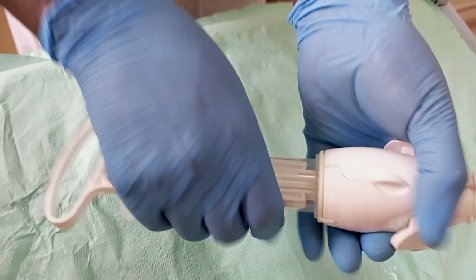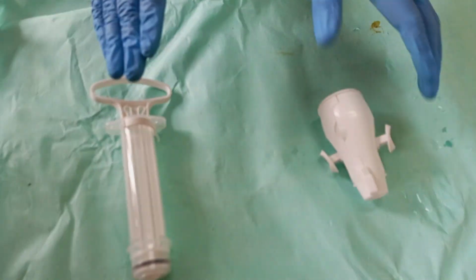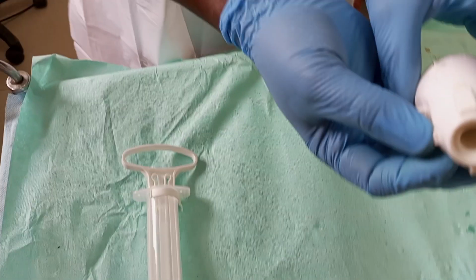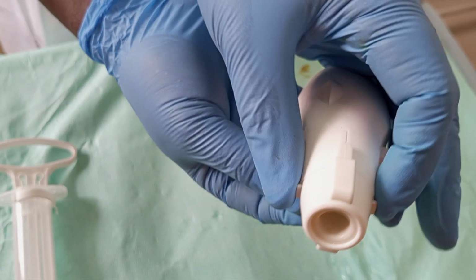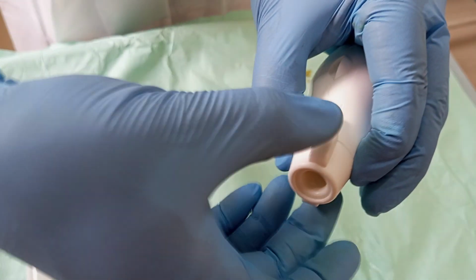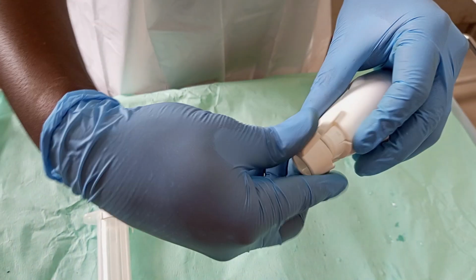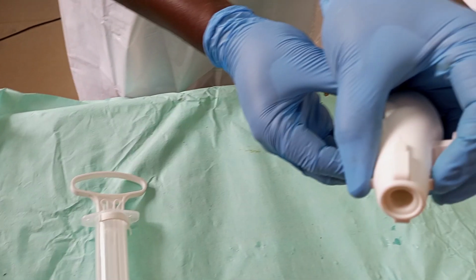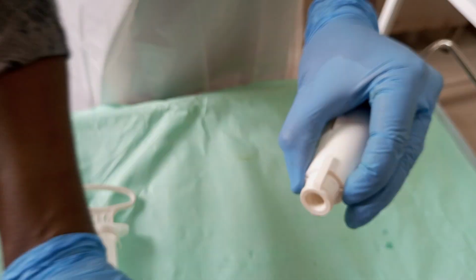First things first, you can easily detach here. There are two different parts. Next, there are two structures protruding here which you can push in to make it easier for you to remove the cap. You can see? Push in these two protruding structures, then remove the cap like this.